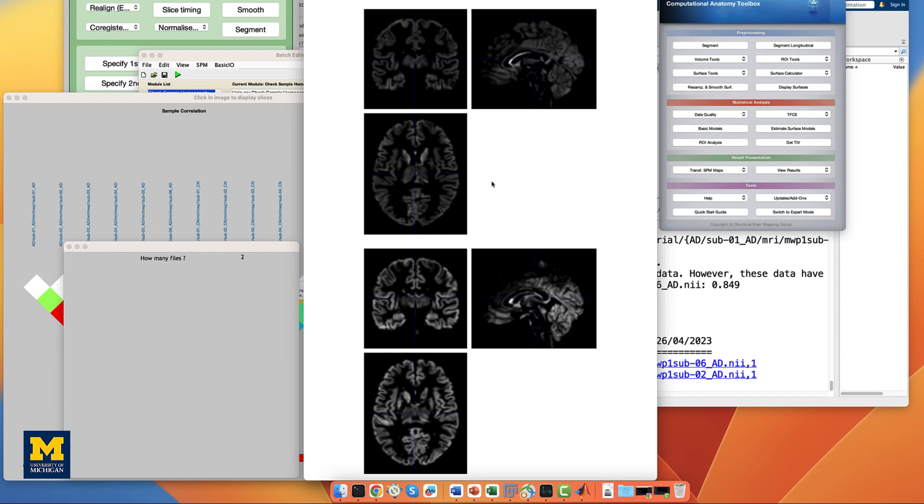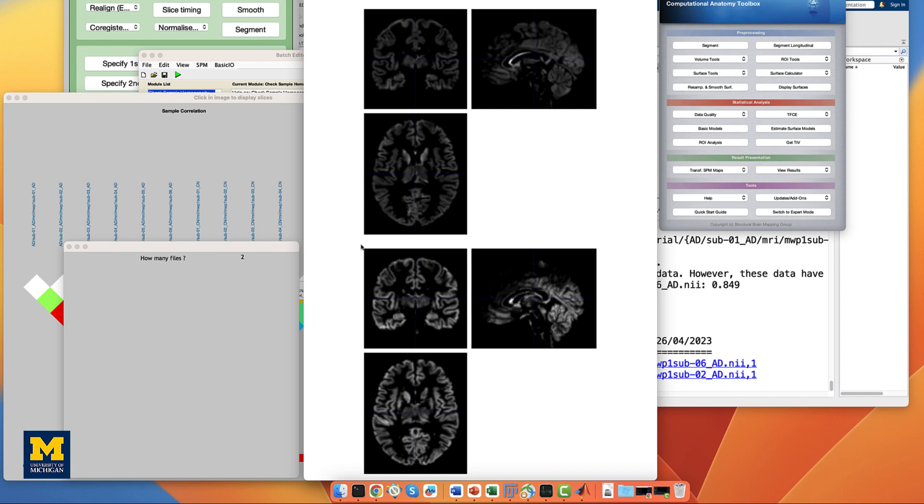Note that even if there is a large amount of deviation, this doesn't necessarily mean there is something wrong with the volume. It's simply a heuristic for selecting the most deviating volumes and then deciding whether that deviation is due to natural variation or because of noise or other artifacts.